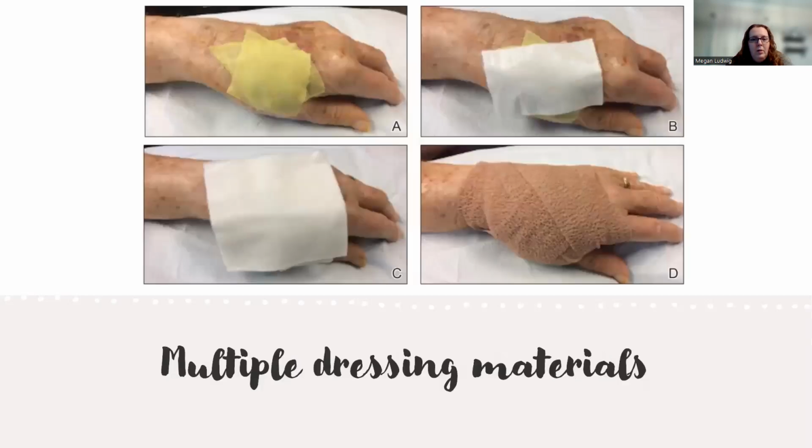So you might have multiple dressings just to cover one place. It depends on what you're working on. This one starts with, this yellow stuff is Xeroform. It's non-adherent, but it has an antimicrobial substance in it. So Xeroform, and then a little bit of an absorbent dressing with a bigger one over top.